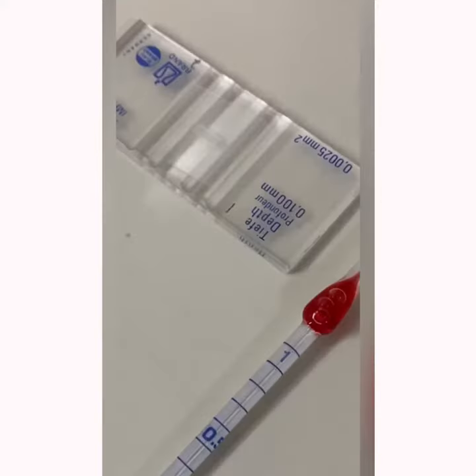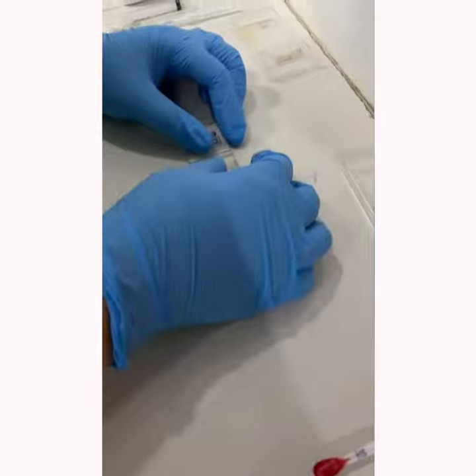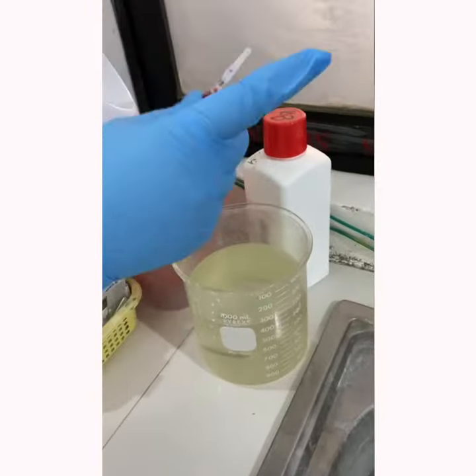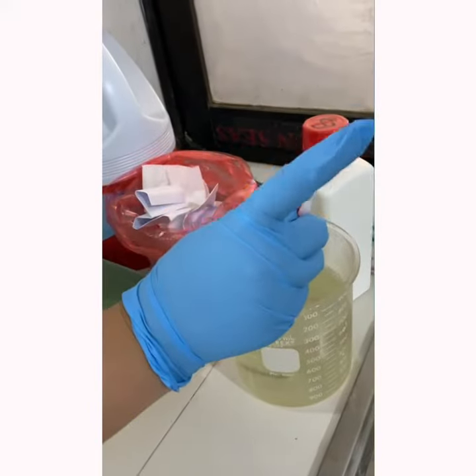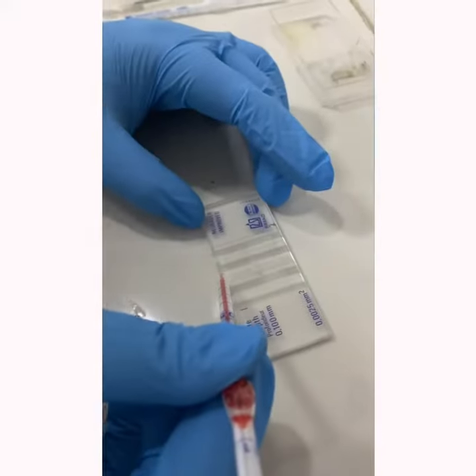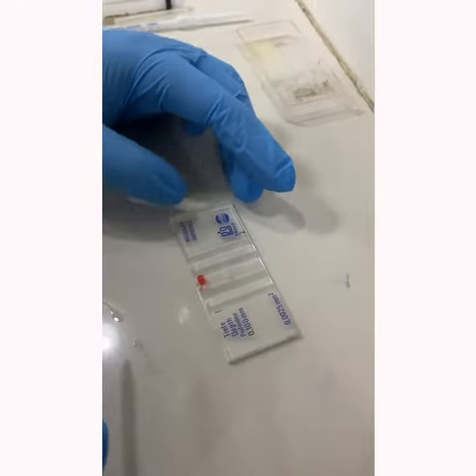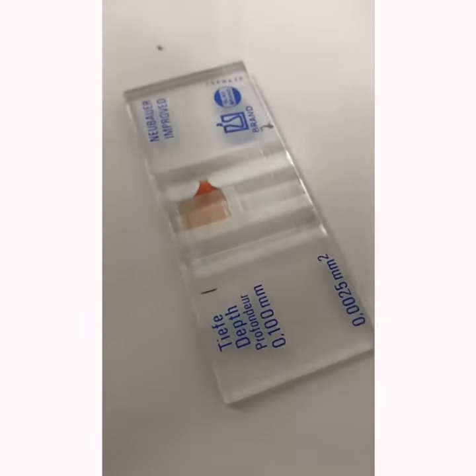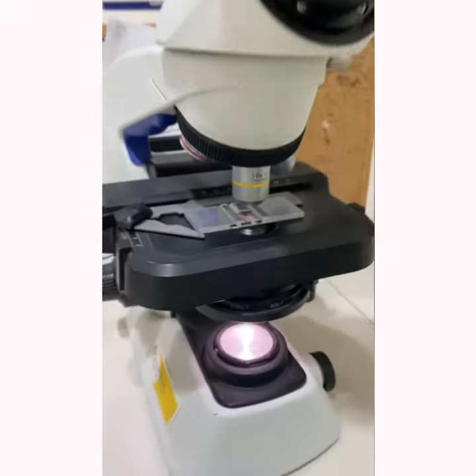Wait for 3 to 5 minutes until the fluid in the bulb turns brown, which indicates that the RBCs have been lysed. A cover slip is placed in the middle of the Neubauer chamber. Disregard the first 2 drops of the fluid within the pipette before dispensing the fluid into the space between the Neubauer chamber. This is a simple counting chamber where cell counts are performed.